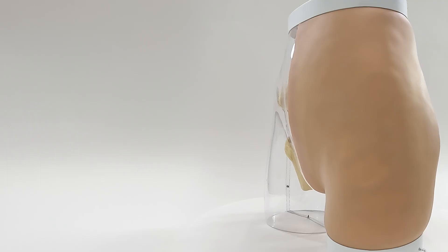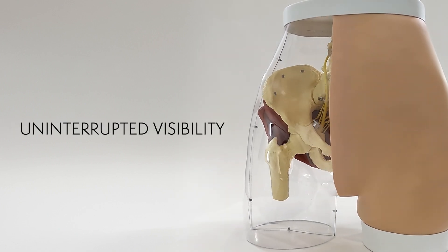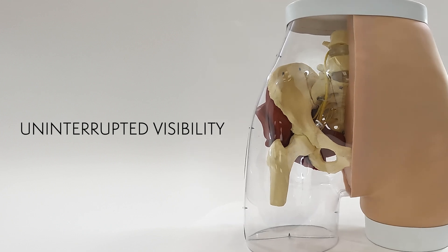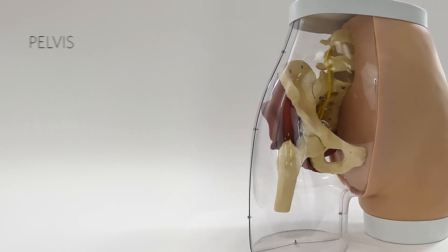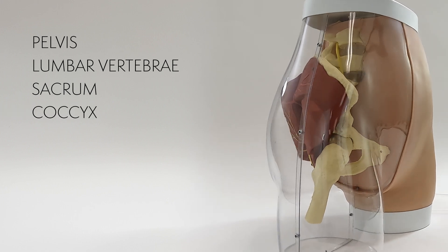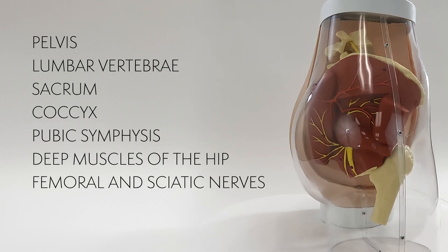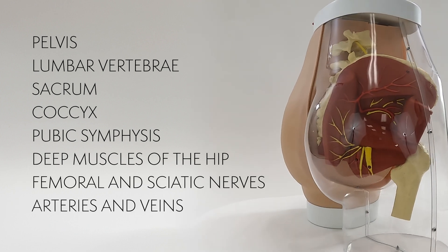The transparent half of this model offers comprehensive visibility into anatomical structures pertinent to ensuring the safety of gluteal injections, including the pelvis, lumbar vertebrae, sacrum, coccyx, pubic symphysis, deep muscles of the hip, femoral and sciatic nerves, as well as arteries and veins.